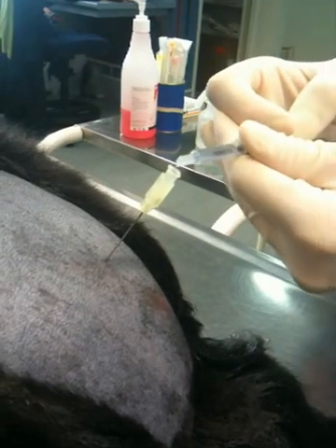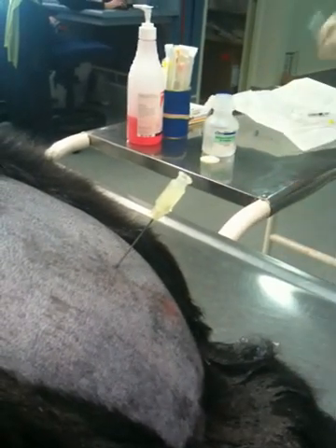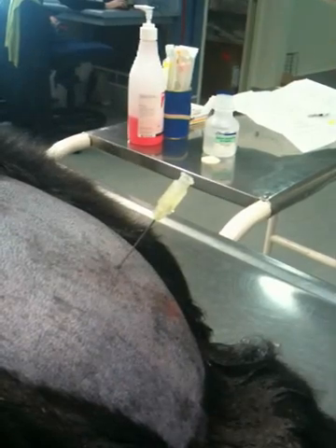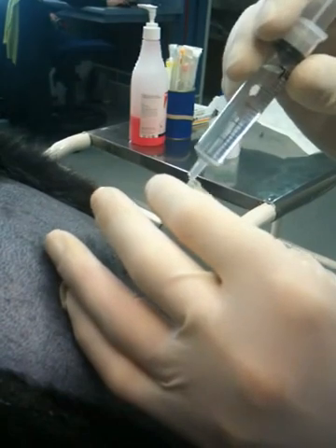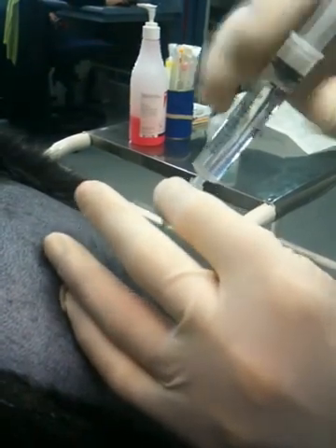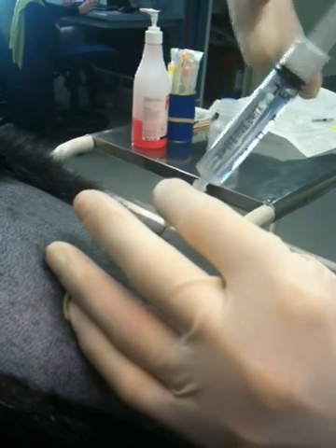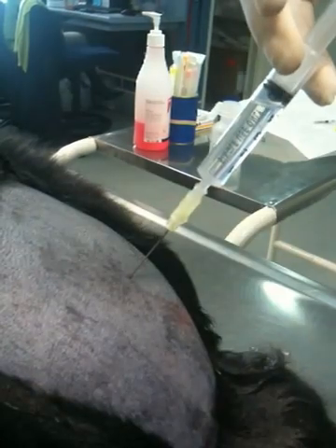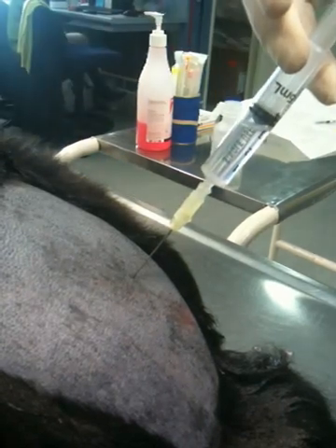See, that's sucking down — can you see that? Yep. So now we've got morphine saline with a bubble of air, and we're going to attach it to the syringe and watch it go down without that bubble being compressed. The bubble's not being compressed — it's going easily into the space.